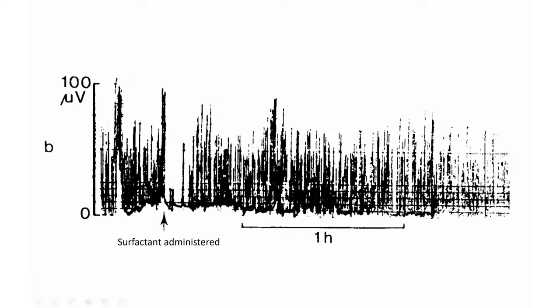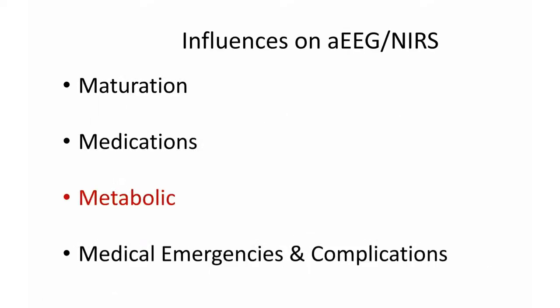So this has been reported in several other case reports. They don't exactly understand what is going on, if there's some sort of ductal steal or if it's just a redistribution of perfusion or what it is. But definitely when they told me the baby got surfactant, I was like, okay, I've only heard about that causing suppression for 10 minutes. So what the heck is going on that there's this ongoing suppression? And that's when the Ativan was discovered. But certainly you can see this very short-term depression.